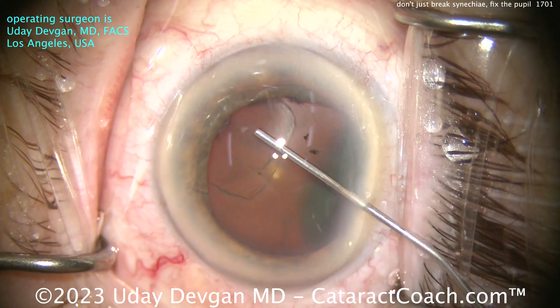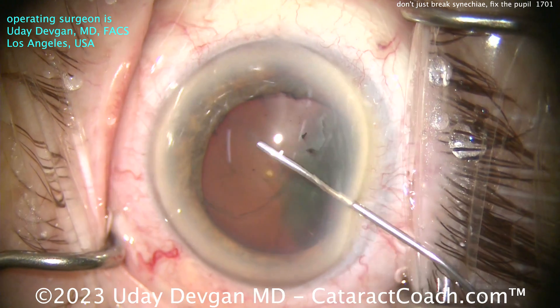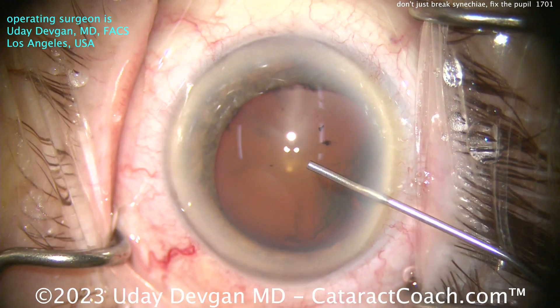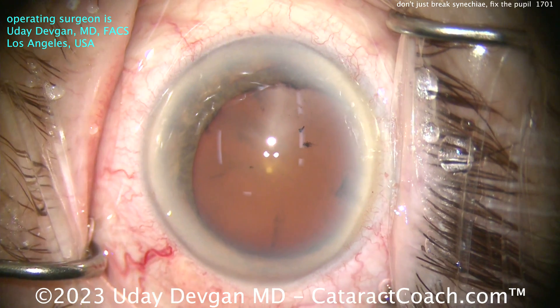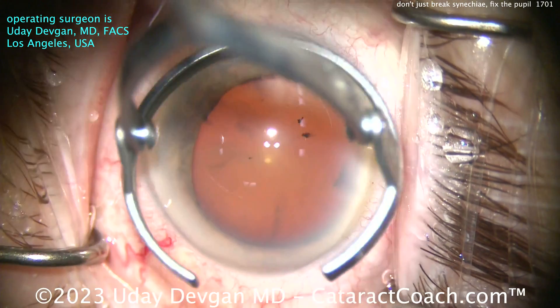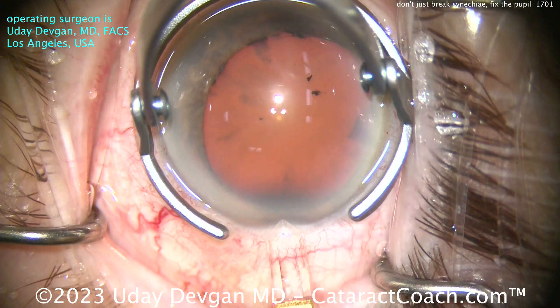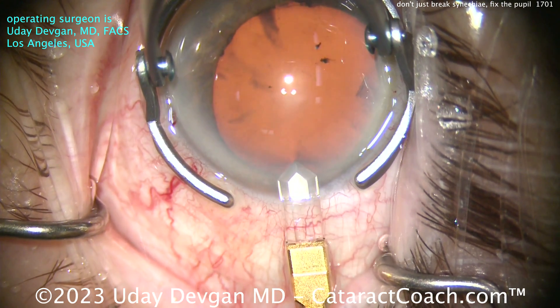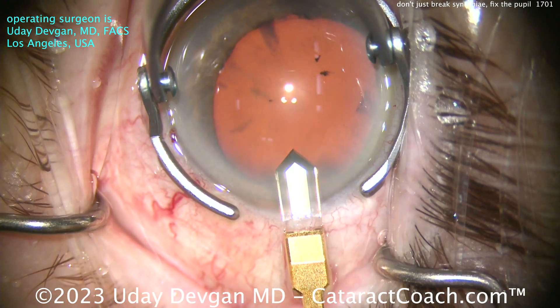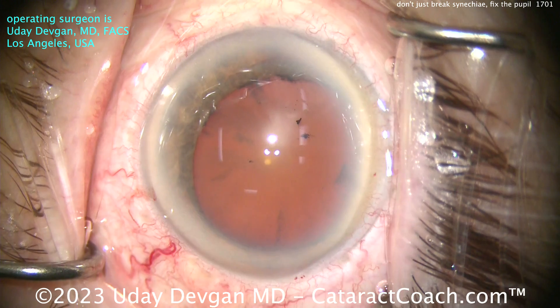So we'll inject some viscoelastic here through the side port. This is a dispersive viscoelastic, getting a reasonable fill of the anterior chamber — I don't need to overfill it at this point, just a normal fill. And we're going to peel off that membrane. First, let's make the incision using a diamond keratome — a temporal incision entering the anterior chamber. That's a pretty nice tunnel length, a small diamond of about 1.8 millimeters. So we'll slightly enlarge the incision.